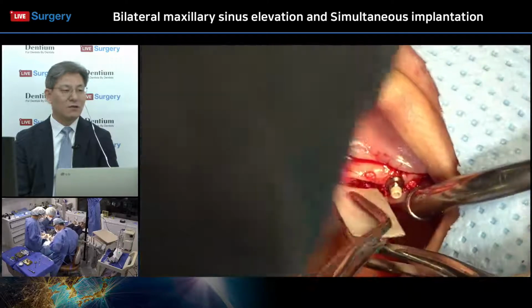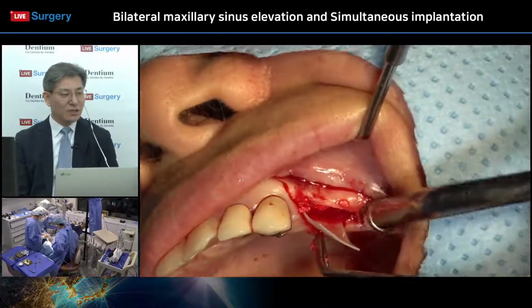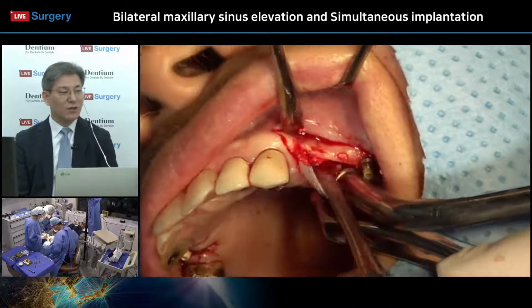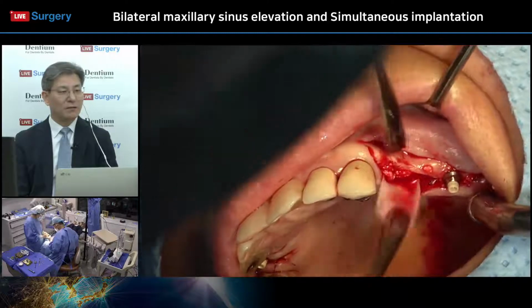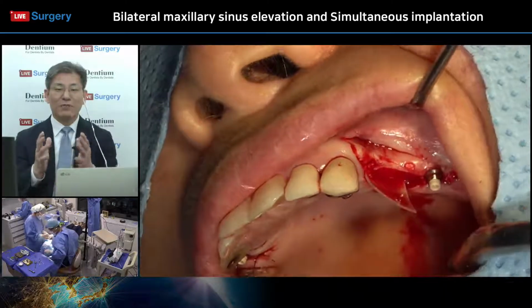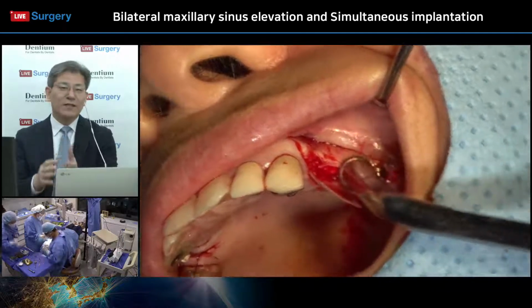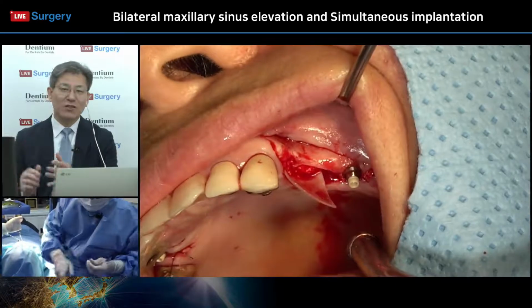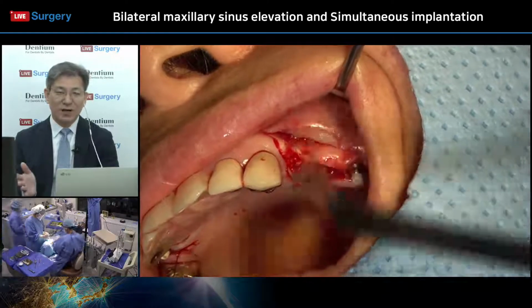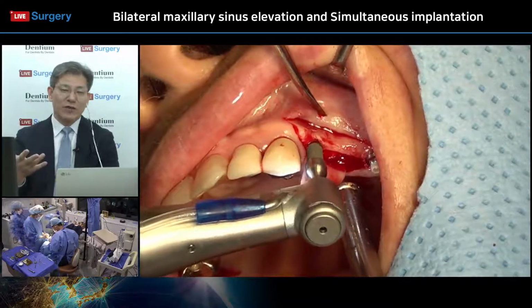Okay, so he is changing the treatment concept using a collagen membrane. If we can see a collagen membrane during the surgery, it means the surgeon wants 100% new bone formation around this bone grafting procedure area, right? So we can see the membrane. It means a GBR procedure. So the surgeon expects total new bone formation.